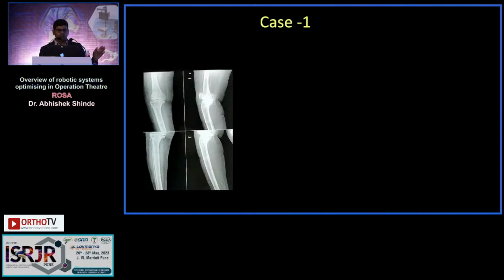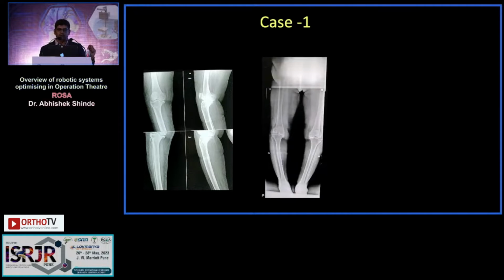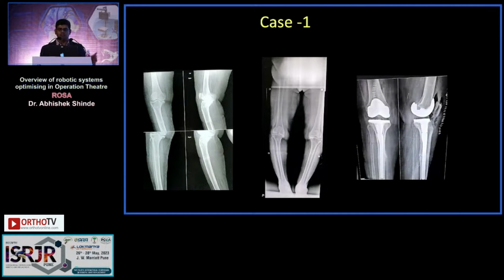So these are some of the cases. You can go through this. You can do the varus with stress fracture. You can do the valgus knee. This is case 1 with the stress fracture. In the morning there was a lecture where you have to take out the tracker pin, particularly the tibial tracker pin. This is the one condition where the tibial tracker pin has to come out before the tibial preparation, because the patient had the stress fracture.